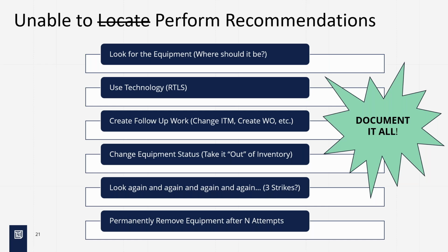Once we attach that to the work order, we put it in a status of unable to locate and close the work order, and our system detects that this work order is unable to locate and generates a new PM work order for the next month. It has a search PM, it says UTL PM. So we do it 3 times.